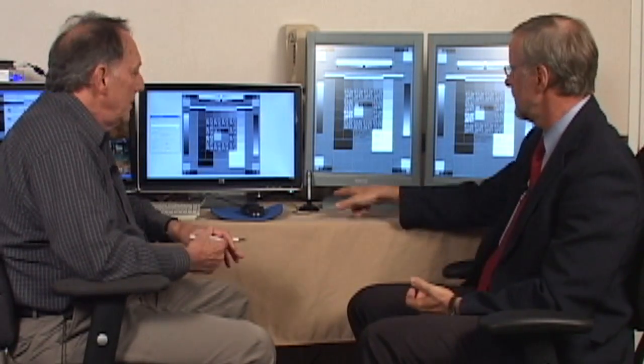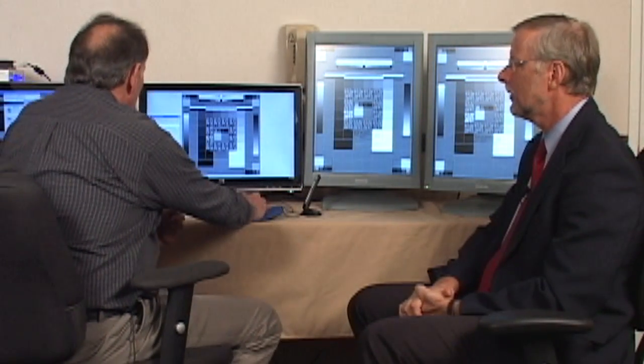And then you would calibrate that if you want to do that with a light meter, like one of these? Yes, this is a very simple light meter that basically sells for under $150. A lot of photography stores have it. Oh, cool. It's very inexpensive, but it's quite accurate, really. Okay. So light meter, a little box, and you can come very close to commercial.